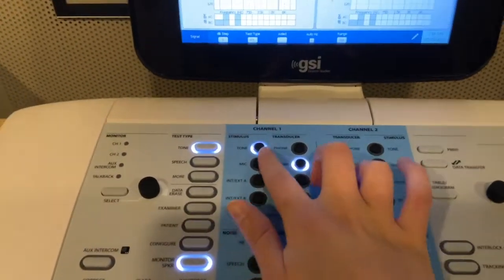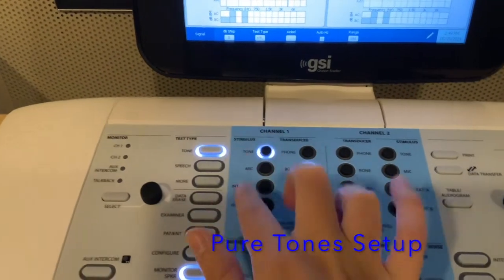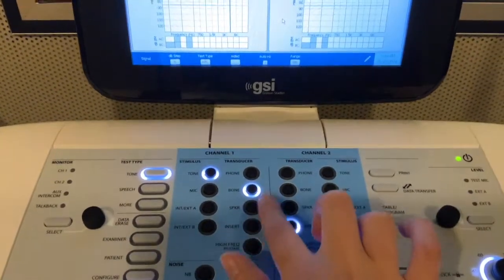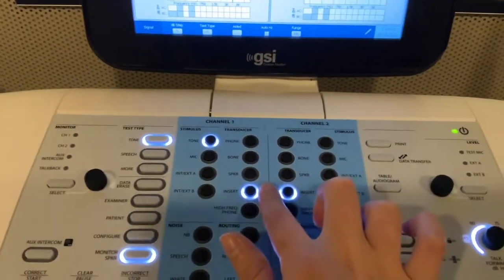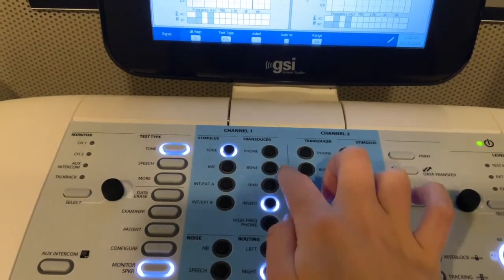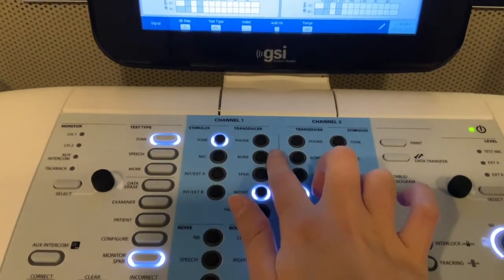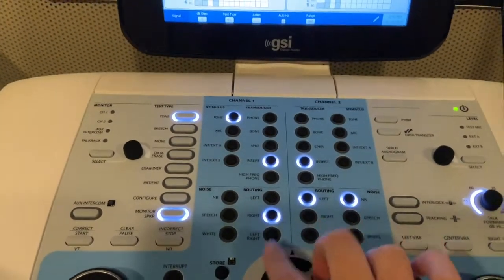So we're using pure tones, so we set it to tone and tone on here. We also want to make sure that we are using inserts. If you were using the over-the-ear headphones, you would select phone. And if we are doing bone conduction, we would select bone. Right now, we're gonna start in the right ear.